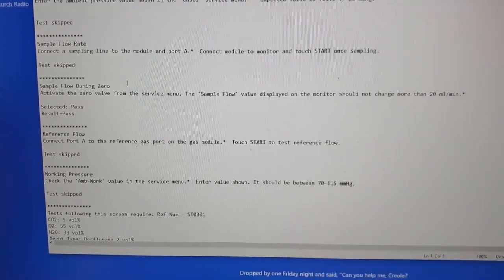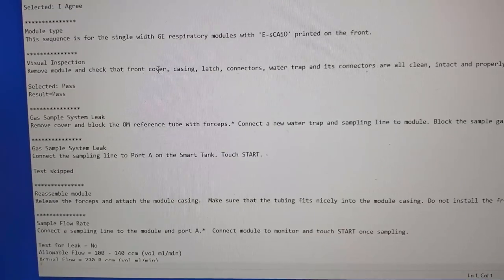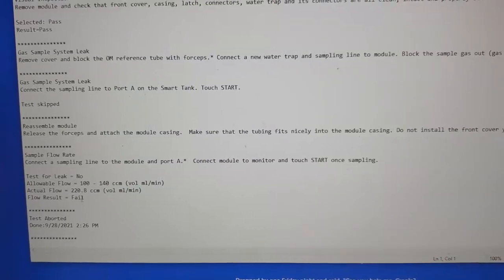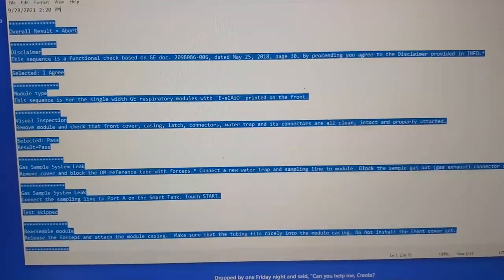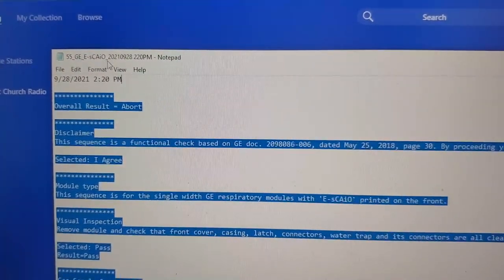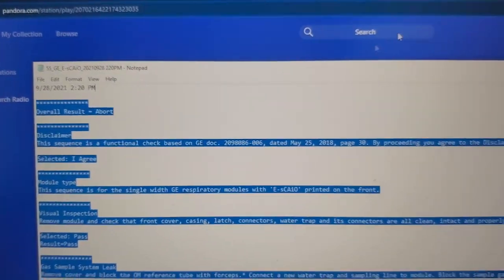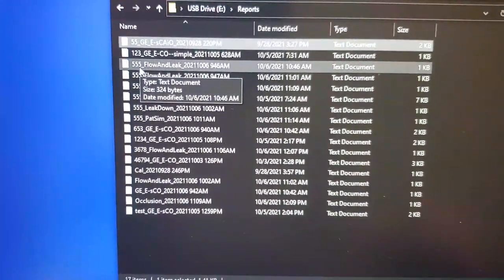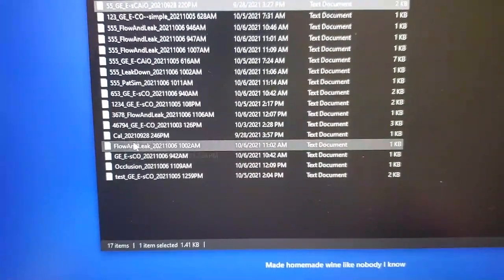You can see it gives results right over here: pass, pass, pass — very neat. On another test, you can see I was getting failed results on this particular module because the module was already broken. What you would do is highlight all the results and paste them into the notes on the work order. You can also just export the file, which is saved as the asset ID, the model, manufacturer, and the date — which is extremely cool because work orders are typically done based on asset ID.